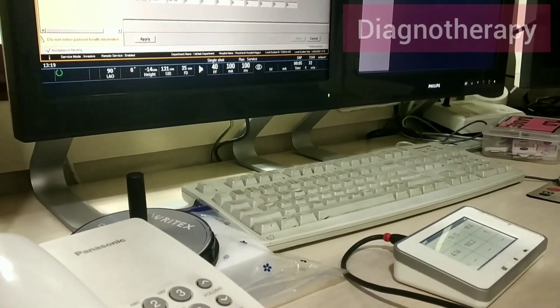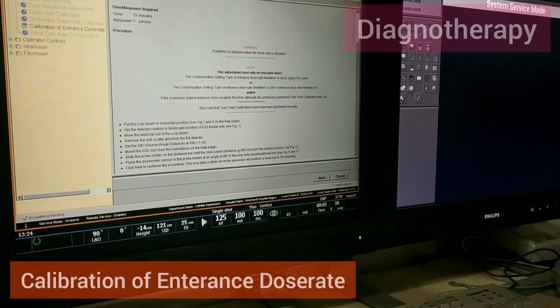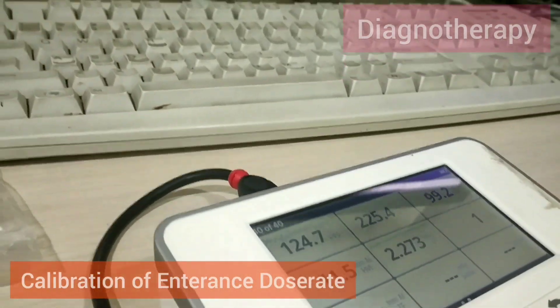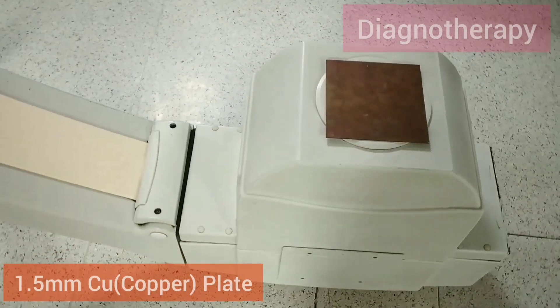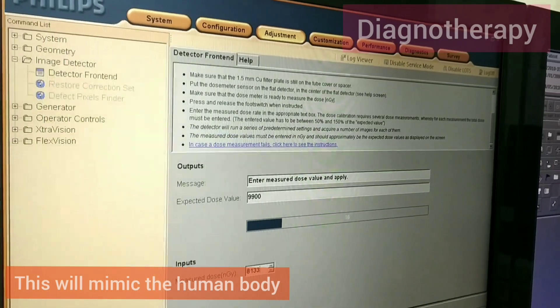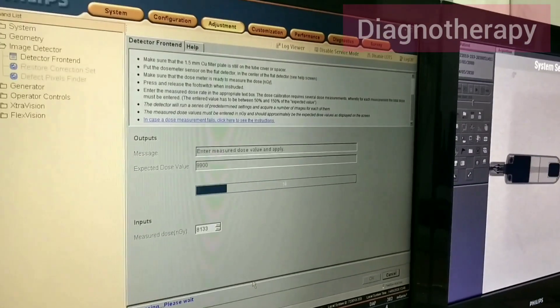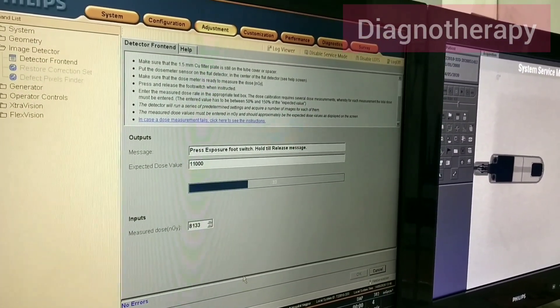Now we will be doing the calibration of entrance dose rate. We mimic the patient by placing a 1.5 mm thick copper sheet on the X-ray tube — this copper sheet mimics the patient's body. At different radiation levels we check the values, and then the machine checks the output against the input.